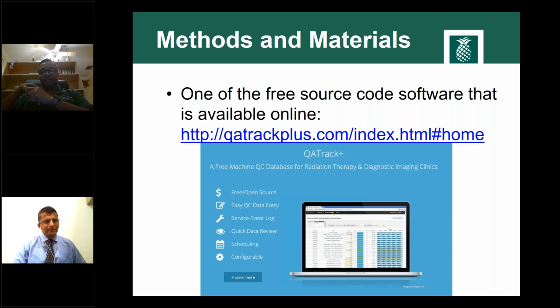And then we put the water phantom, the 3D water phantom, and we do spot checks. We have a subset of PDDs and TPR, as well as all that information, and then we take the output factor at different positions and so on. So I have a spreadsheet which we developed over the last 10 years from the TG142 era, and we update that on a regular basis every year. Because we have a big group now, we go through that again and again and make sure we are up to date. And if there is something more the team has to propose, we make that sheet up to date.